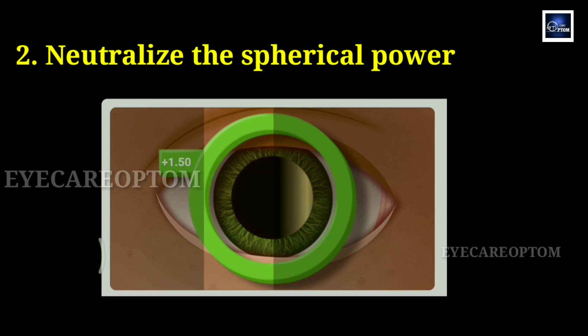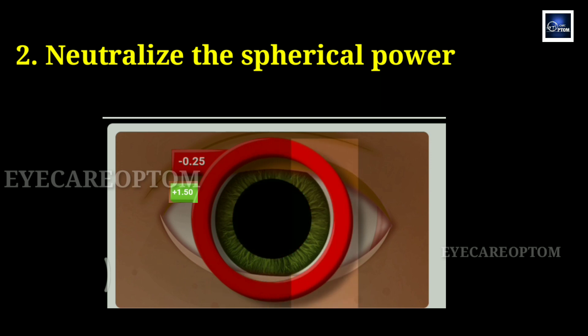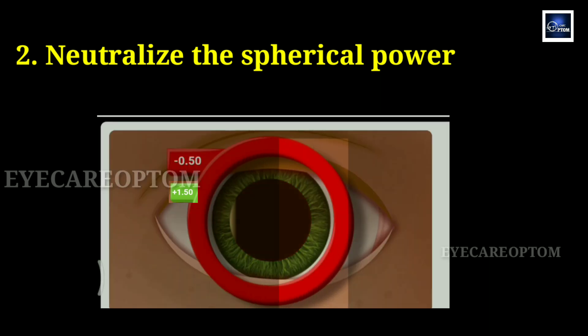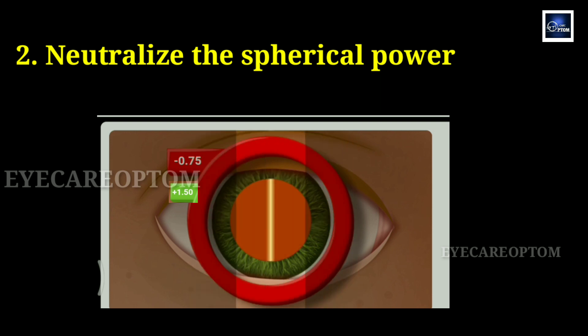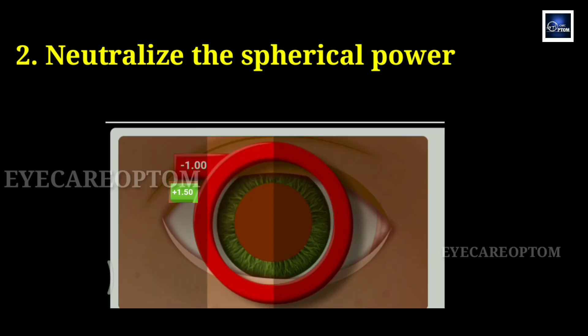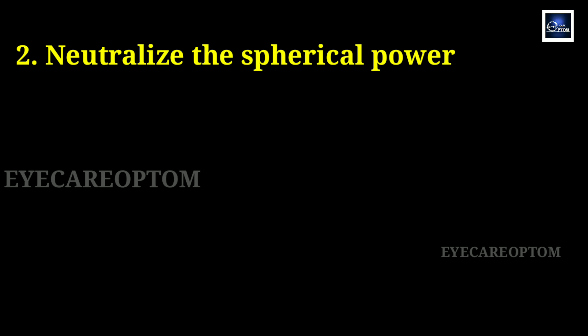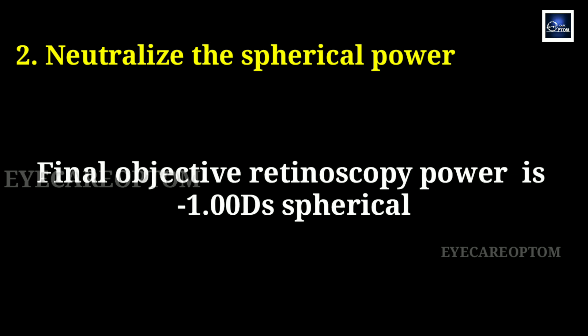Here we see against movement, so we need to add minus power, going in 0.25 steps. We place minus 0.25 diopter — still against. Next, minus 0.5 diopter — still against. Next, minus 0.75 diopter — still against. Next is minus 1 diopter — now no movement, so it is neutralized. Checking the horizontal meridian also shows no movement, so that is also neutralized. The final objective retinoscopy power will be minus 1 diopter spherical.